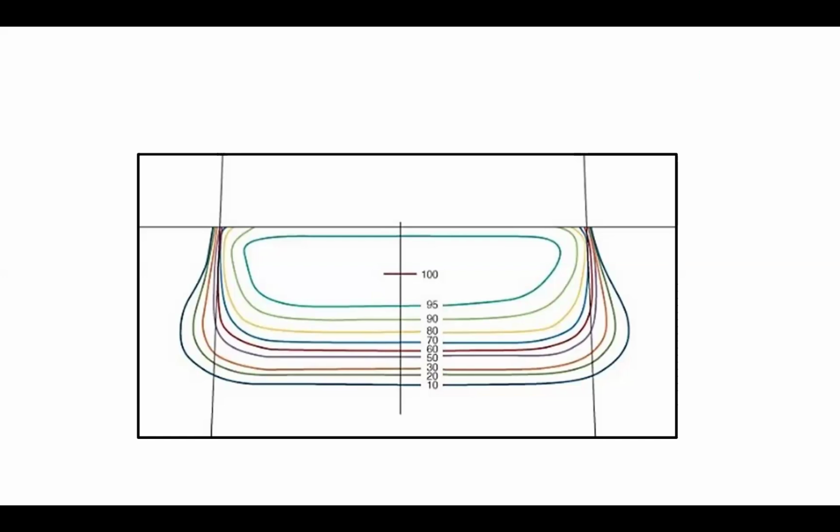So we can use it for surface tumors, it's better. We can use the electron beam, sir. No. I'm talking about based on these isodose lines, say something. Don't say generally what you can do with electrons. Based on these isodose lines, tell me something different which is clinically related.